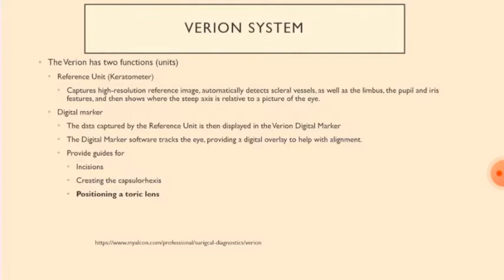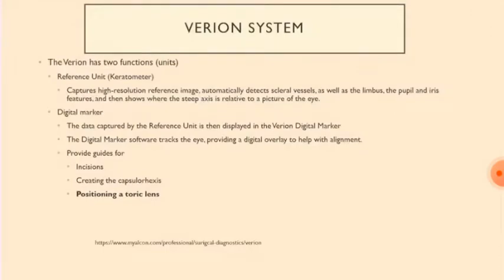Incision is very important. There are various softwares you can use, and I had done my own calculation of how much astigmatism I change when I incise at a certain area. We were used to 2.75 knives, and I knew exactly how much I was changing when I came to Pakistan, and eventually 2.2 became popular. I asked one of the people from Alcon, and they gave me software, an Excel sheet really, where you put your data in. You can all do that, it's pretty straightforward. It gives you exactly what your surgically induced astigmatism would be, and it is worth doing.